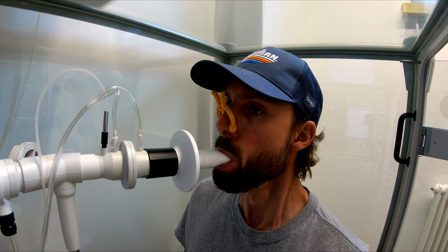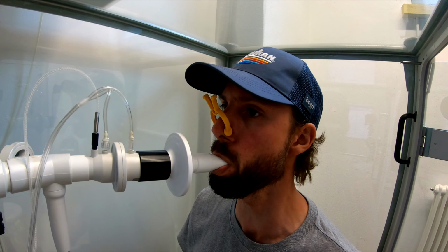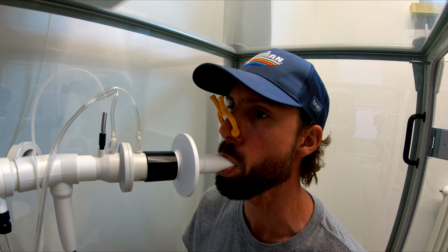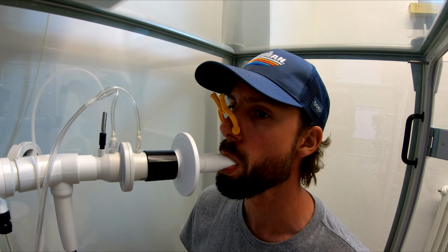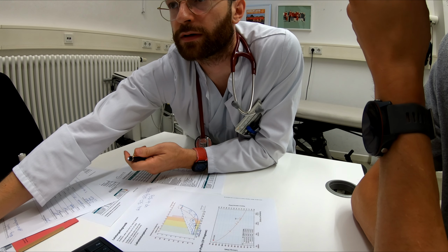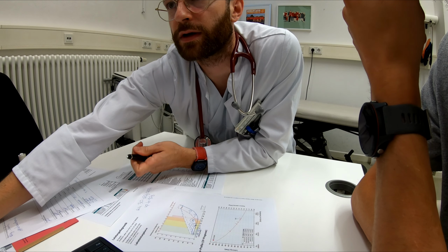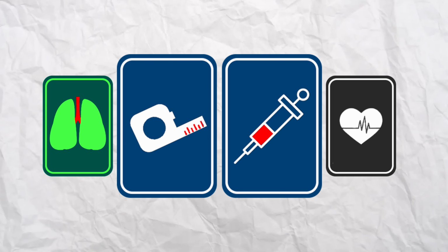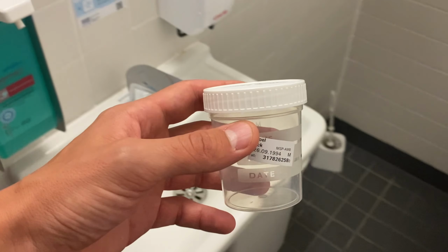And exhale, continue, till you can't anymore, and continue. So we see this is the breathing in, this is the breathing out. Looks perfectly fine. The next tests are sample tests of blood and urine to check for general health factors.